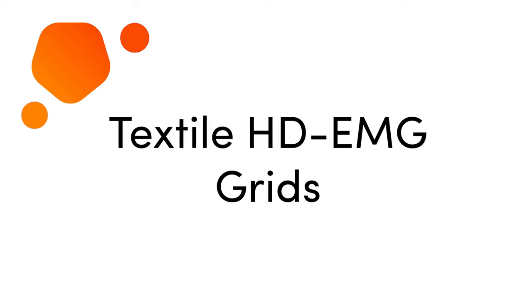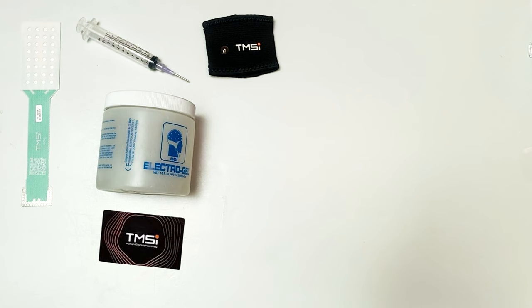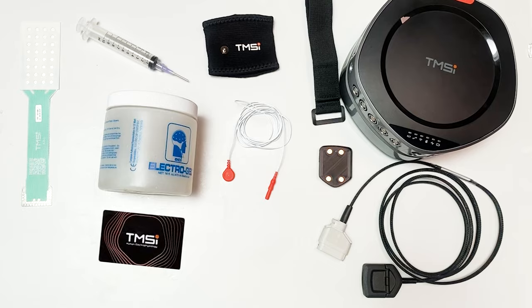In this video, we will show you how to use your textile HDEMG grids. For this video, you will need your textile HDEMG grid, a blunt needle syringe, electrode gel, applicator card, wristband damped with tap water, patient ground electrode, cradle with straps, adapter cable, and your TMSI amplifier.